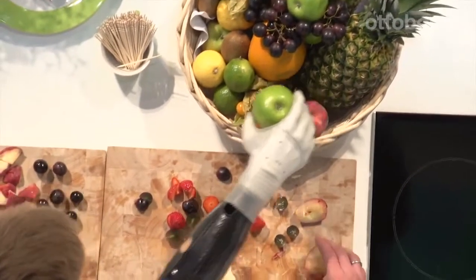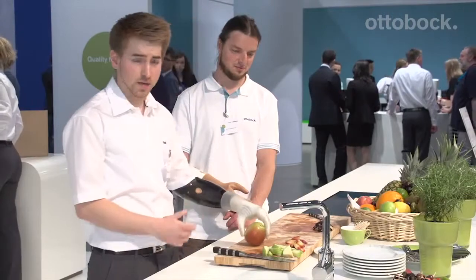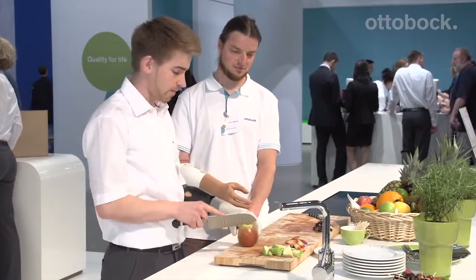Now I can rotate to grab the apple and move it over here. That means I'm not just faster — I also relieve the strain on my amputated side.